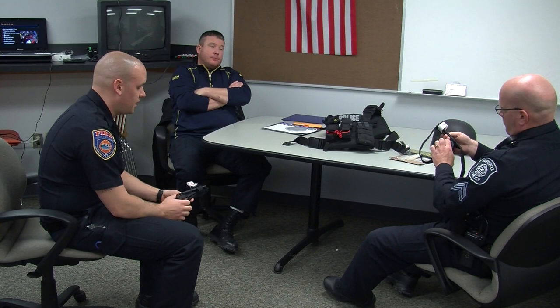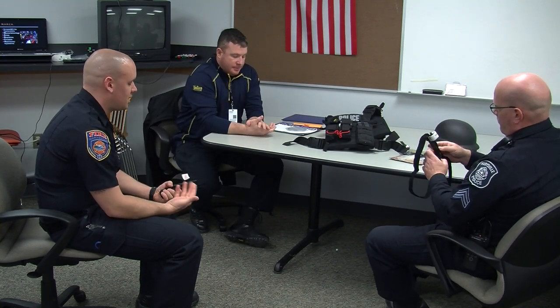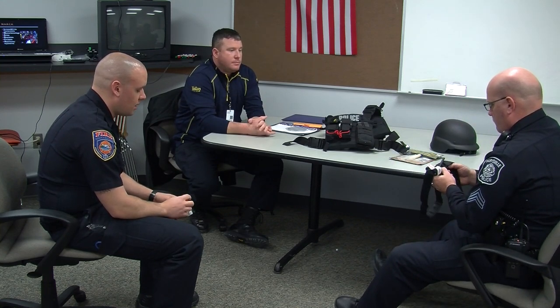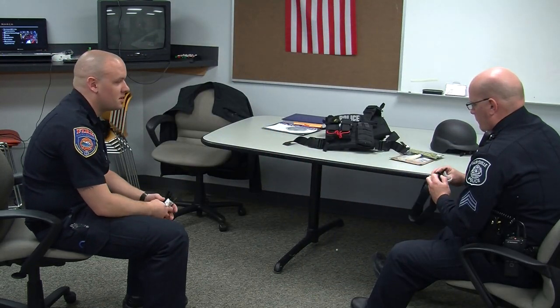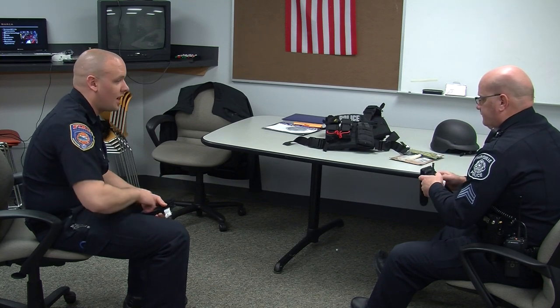These things are really, really good and simple, but it does take some practice. You gotta practice with it and see how it works. We were practicing with them today, and we gave them a 20-second time frame from when we called out whatever extremity it was that they had to have completely tight.